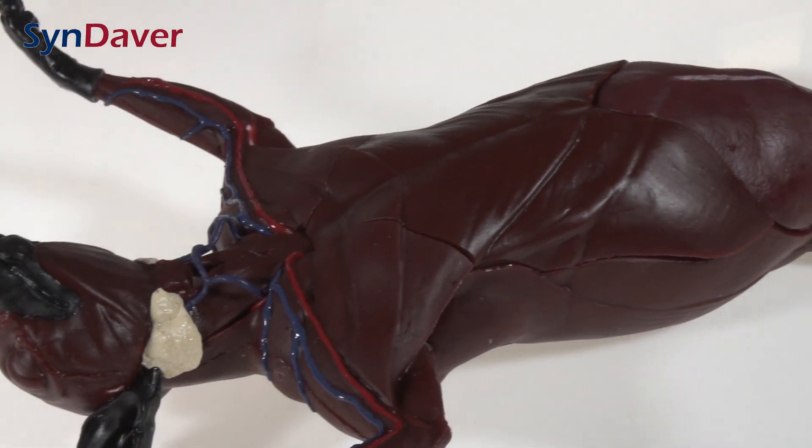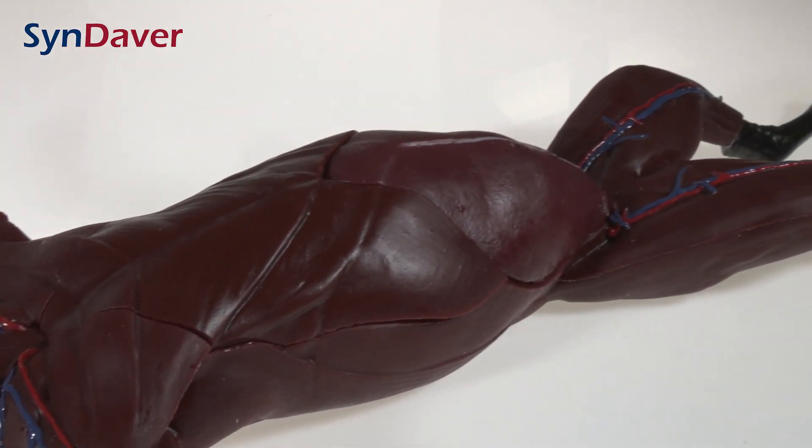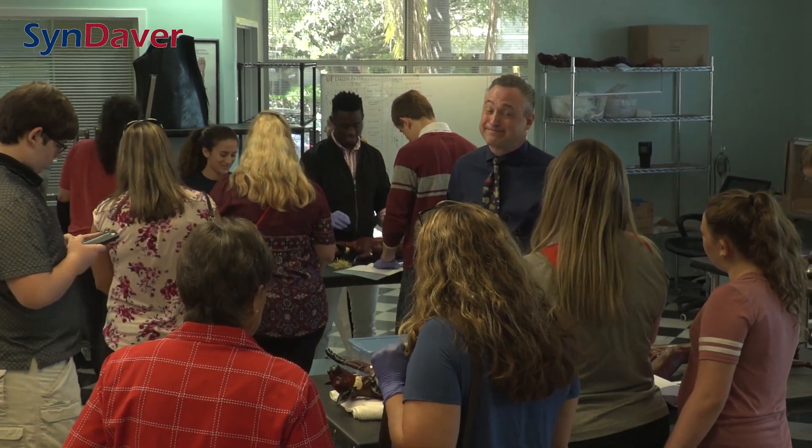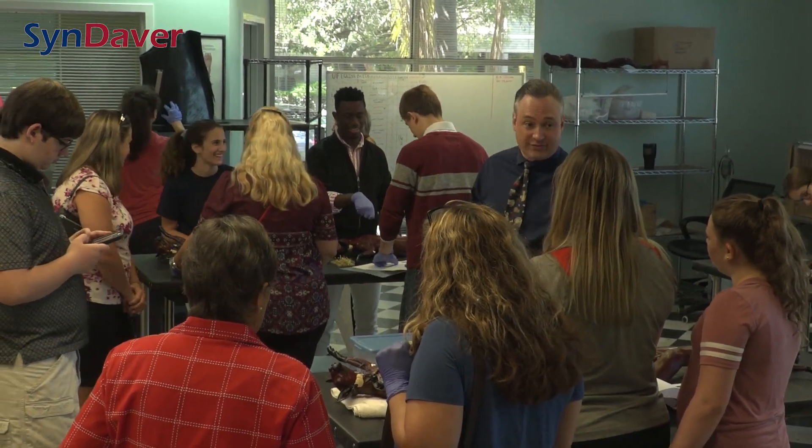Let me introduce you to CopyCat. This is our new SynDaver anatomical feline trainer. It's designed to take the place of feline dissection in the classroom. Our goal is to engage students so that they can actually learn mammalian anatomy without having to sacrifice a cat to do that.